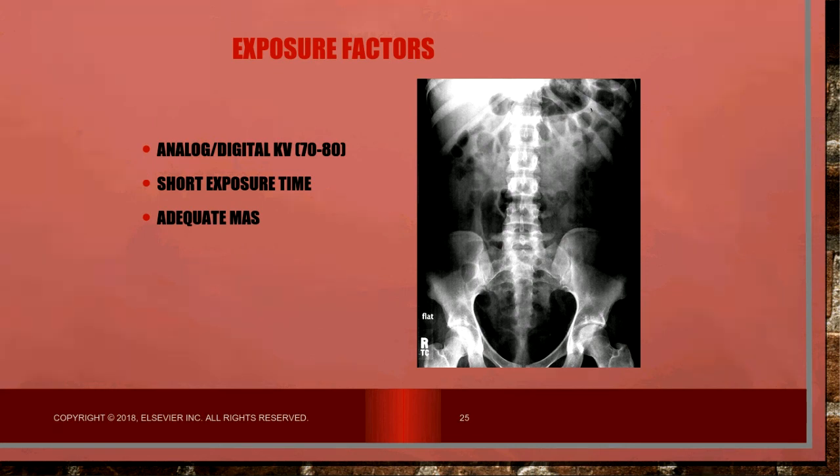And the other thing that I'd like to point out on page 115, they do give you some special patient considerations with regard to pediatric patients, geriatric patients, and obese patients. With pediatric patients, the biggest thing that we are concerned with is motion. So you definitely want to make sure you have the least amount of exposure time. With older patients, typically it takes a little bit longer to explain the exam and what we need from them to do. And you want to make sure you give them careful breathing instructions as far as taking a breath, blow that breath all out, and hold it out.